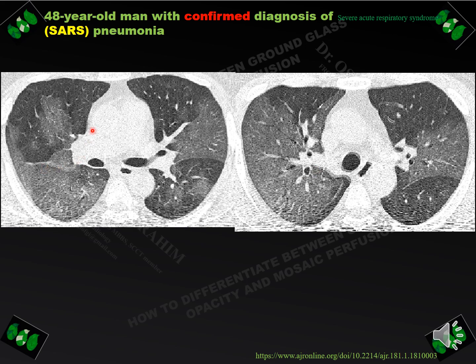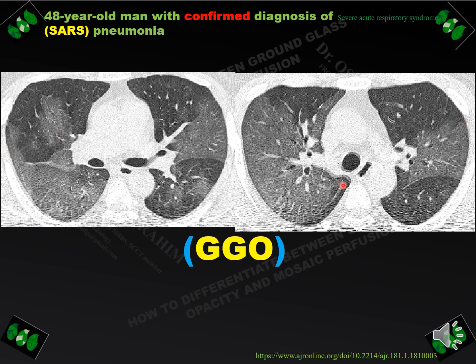This patient has abnormal heterogeneity of the lung, with areas of high attenuation and areas of low attenuation. The first question is: which area is the abnormal one? Look for the blood vessels in each area. If they are equal in size, the high attenuation area is abnormal, representing ground glass opacity. This was a patient positive for SARS with multifocal ground glass opacity seen throughout the lung.